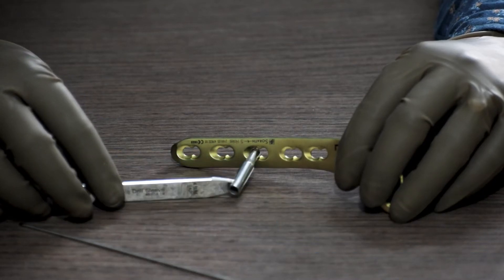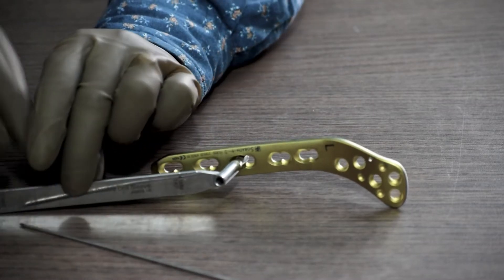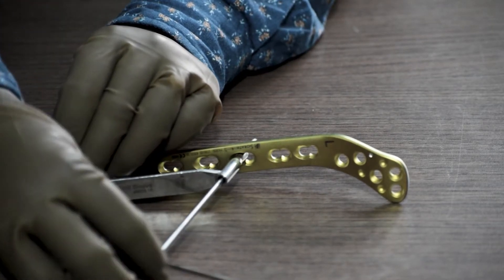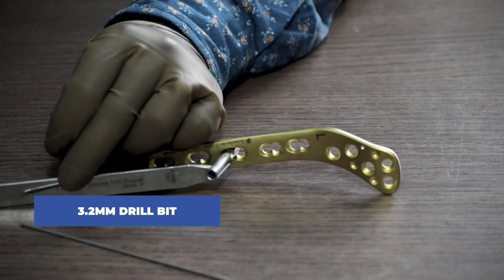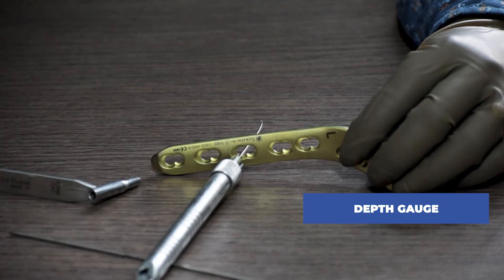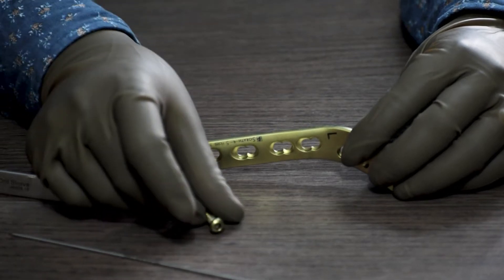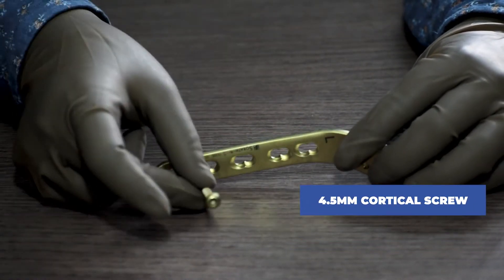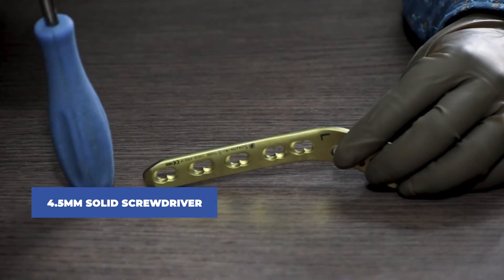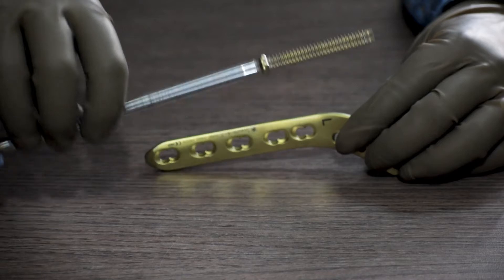We place the 4.5mm drill guide in the non-locking hole of the plate and drill through the non-locking hole with a 3.2mm drill bit. After drilling, we take the measurement with the help of a depth gauge. Once the length is measured, we take a 4.5mm cortical screw of the measured length and, with the help of a 4.5mm solid screwdriver, insert and fix the cortical screw in the non-locking hole.